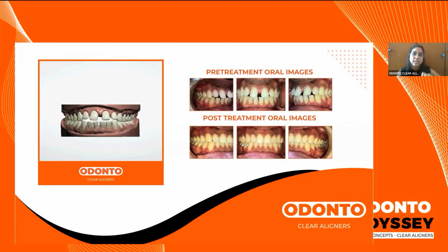I would also suggest that along with a burr, you opt for an IPR gauge. The gauge has tiny thin individual metal leaves, marked as per the size, and you pass that between the surfaces where you have done the proximal reduction. If you have done, say, 0.3 mm of proximal reduction, your IPR gauge has to go perfectly between the two teeth smoothly. There should be no tugging, and you can accordingly check that.